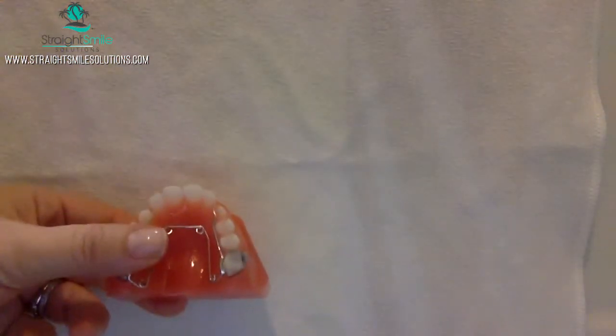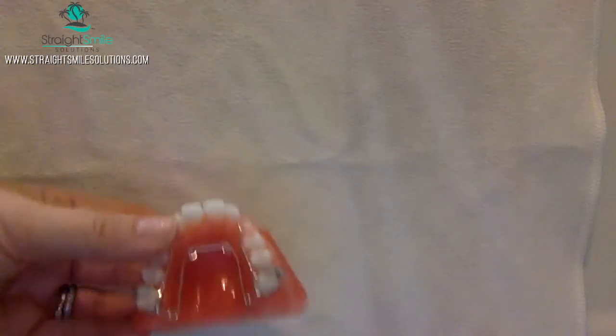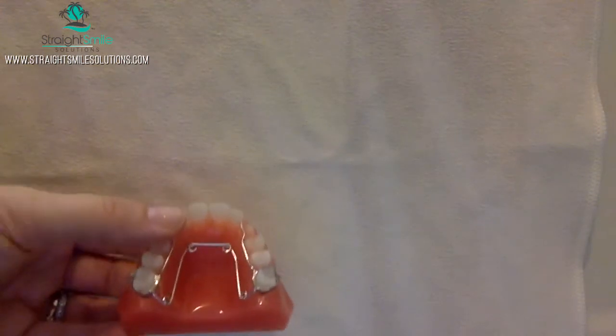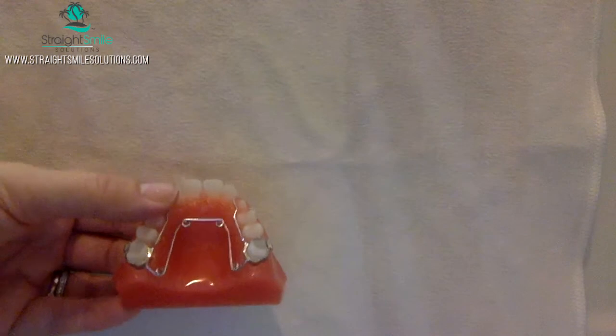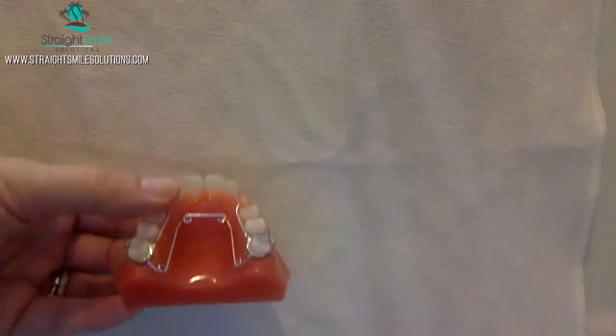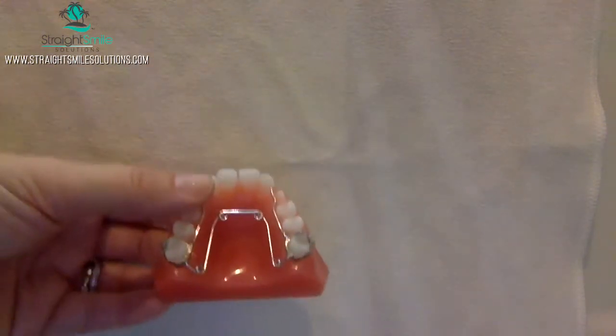This is Dr. Amanda with StraightSmile Solutions, and we're here today to talk a little bit more about activating the QuadHelix. I know you saw in my previous video that the model was cemented, so I wasn't able to show you how to activate it. I just told you theoretically how to do it, but I did get another model sent to me by Specialty Appliances Laboratory. Thank you very much to Olivia and Scott for sending me the other model so I can show you all how to activate it.